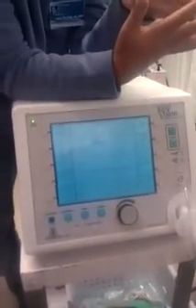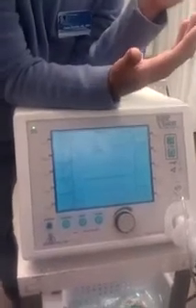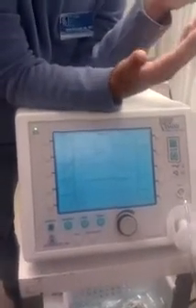This pressure will help with that, obviously with the expiratory pressure. A lot of the times it's used as a ventilator. And again, I told you guys before, this will help stave off intubation. If you get there in time, with congestive heart failure, it's quick, and you come right off. But everybody's different.